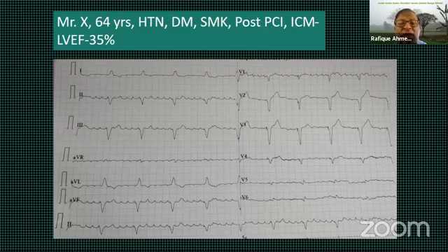So I actually would have tried cardioversion, because this is a 64-year-old patient with cardiomyopathy. Now, cardioverting this patient with a single chamber pacemaker is not going to help much. Actually, it will go back into flutter quickly. What this patient ideally should have had at this point, with the EF 35% and I'm sure CHF, is an upgrade to a biventricular defibrillator with cardioversion and anticoagulation. And that will hopefully improve his ejection fraction and everything.